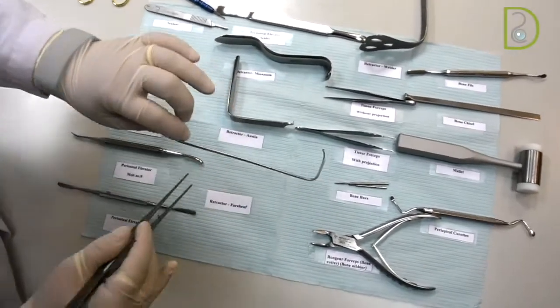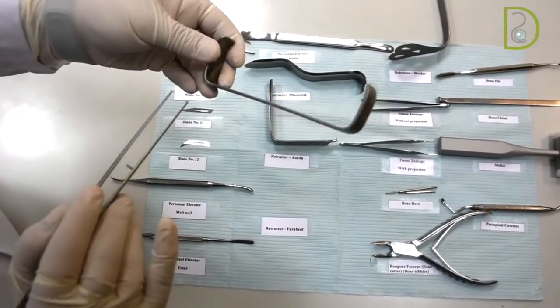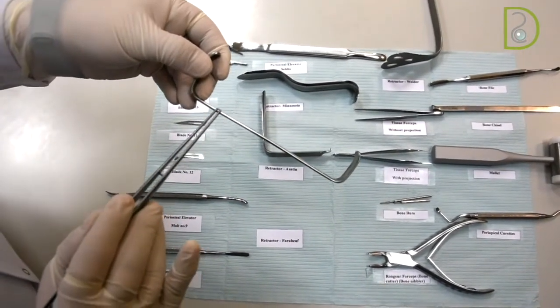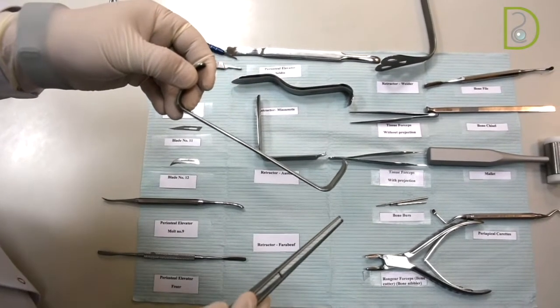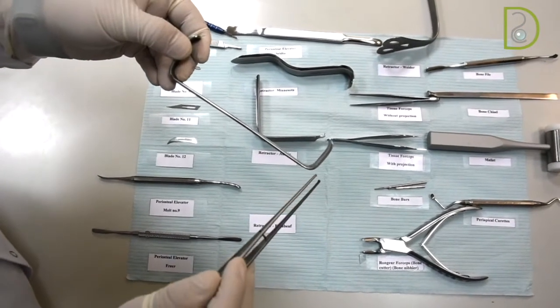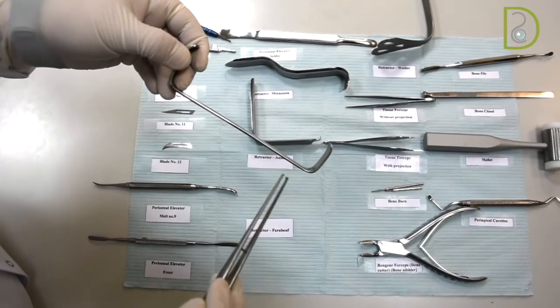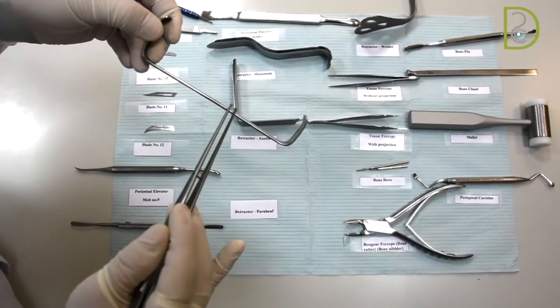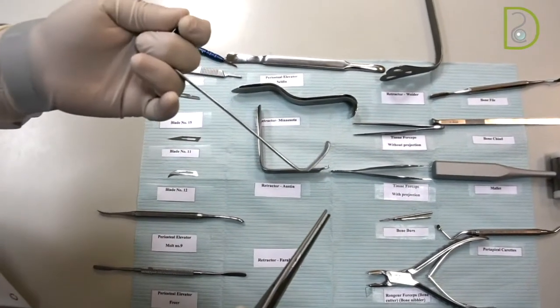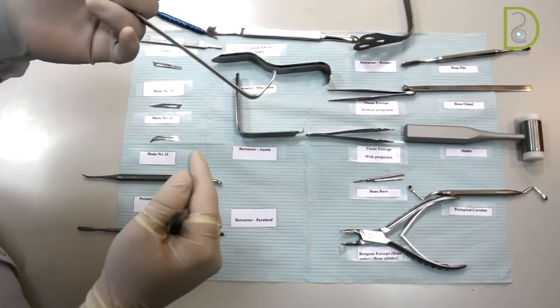This is Farabeuf. Usually Farabeuf come in two pairs. The other pair is exactly the same. This is to retract the tissue on the right and the left at the same time. As we have said previously, for example, in alveoloplasty, there is a whole ridge you have reflected the tissue from, so you need to reflect at the same time on the right and the left side. So use Farabeuf for this purpose. On both ways you will hold it and retract.